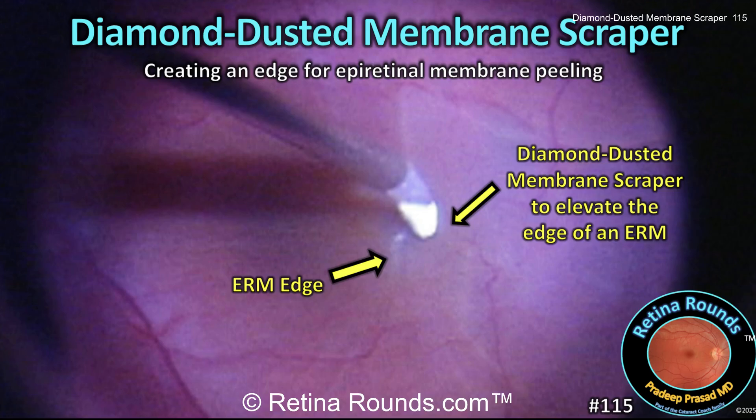Retina Rounds, episode number 115, Diamond Dusted Membrane Scraper. When performing epiretinal membrane peeling, the first step is to elevate an edge of the ERM, which can then be grasped and used to extend the membrane peel. There are a variety of techniques for creating this edge, and in today's video we'll show you the use of a Tano diamond dusted membrane scraper.